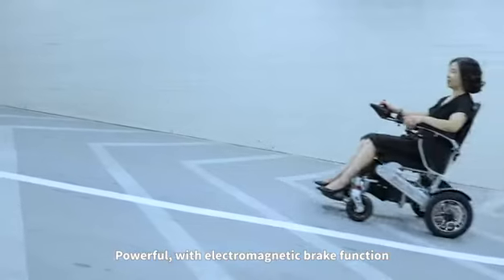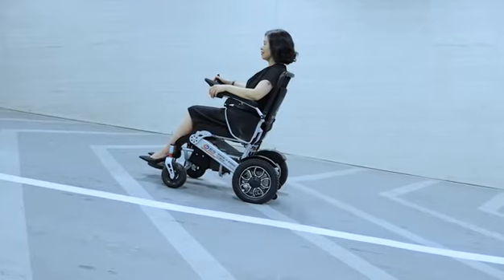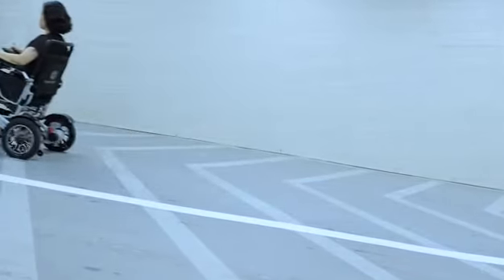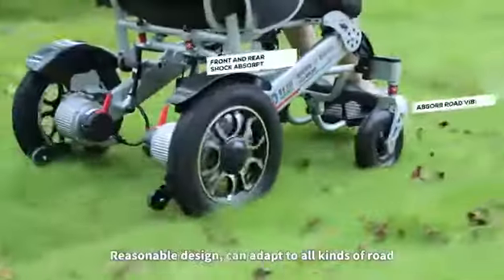Powerful motor with electromagnetic brake function for added safety. The reasonable design allows it to adapt to all kinds of road surfaces.